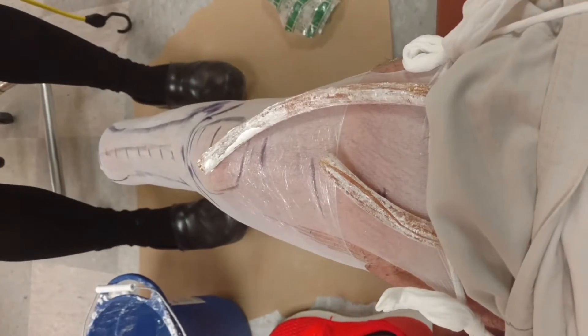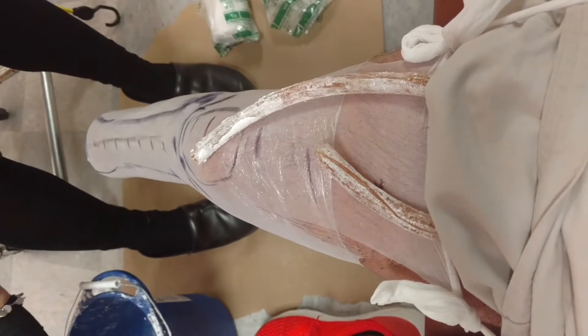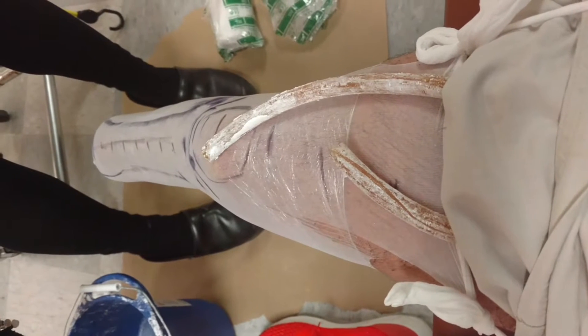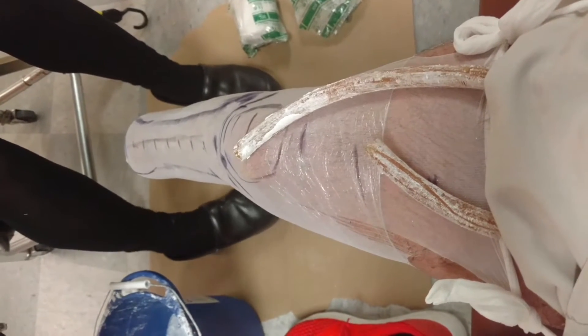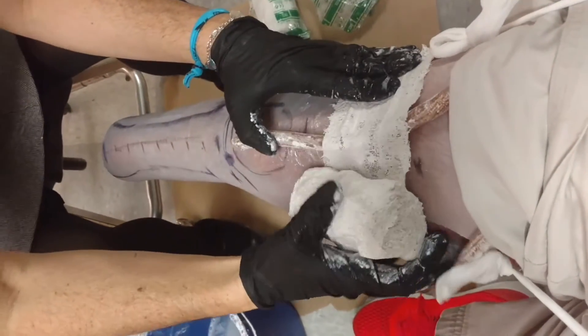I'm about to cast for my second leg, my second socket. All the markings and stuff were for the first liner, custom-made liner. Push-in, Autobot. Can you scoot forward a little bit? So now this is for the casting process.